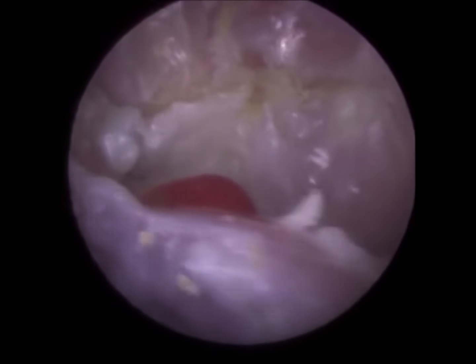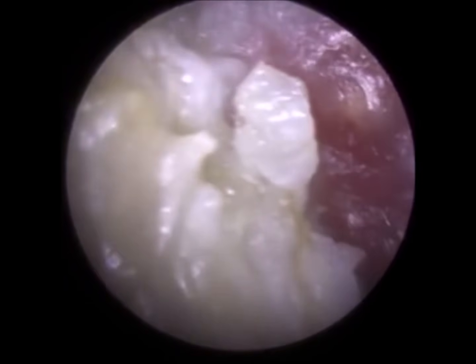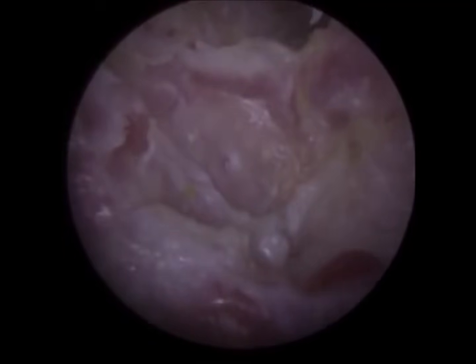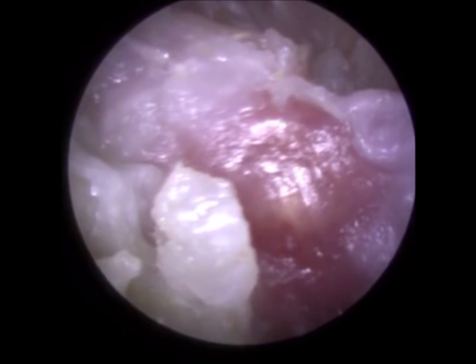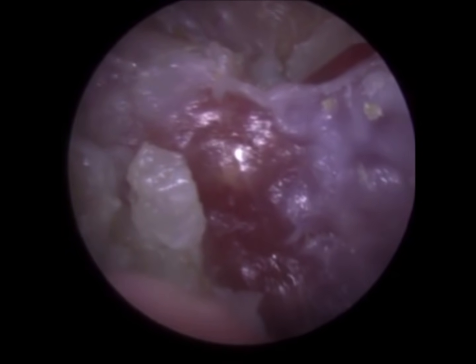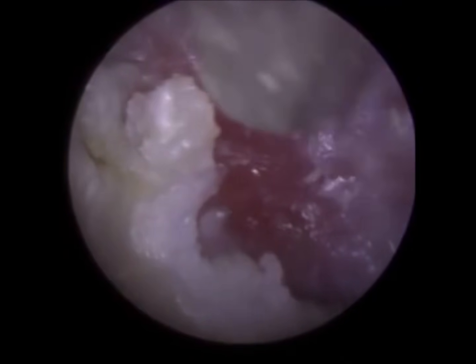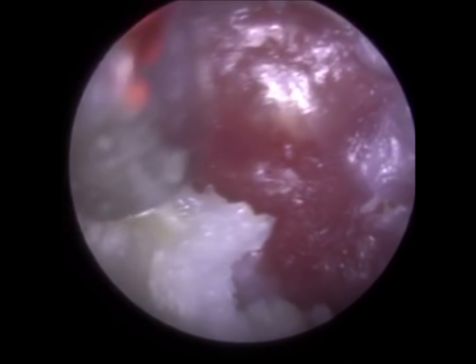So, again, the eardrum is right on the right hand side upwards. It's almost north, and again, I don't know if we've got all of this out. It was a few weeks ago we took this out. I think I got as much out as I could really, pending how much the patient could tolerate in terms of the procedure and also our time, because obviously we've got other patients who are booked in, and this is a lot more.